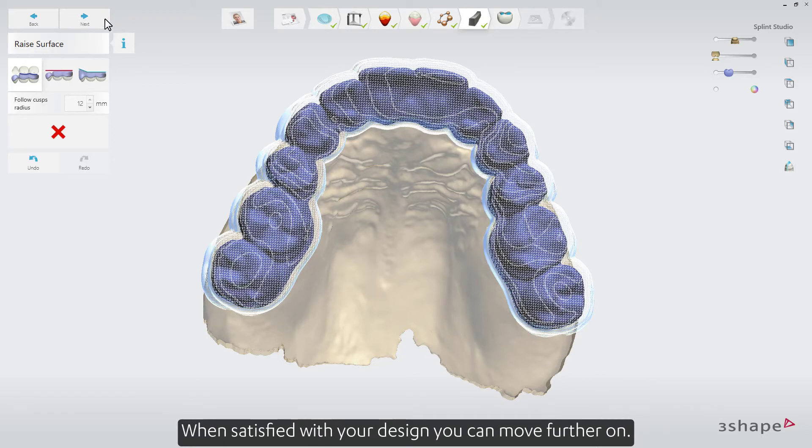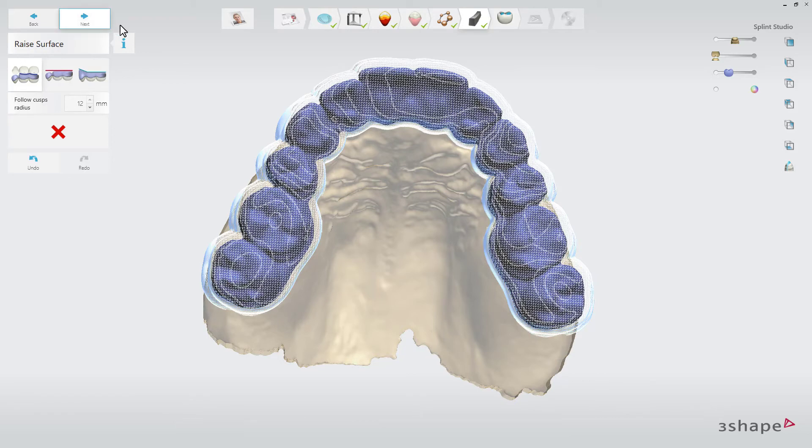When satisfied with your design, you can move further on.